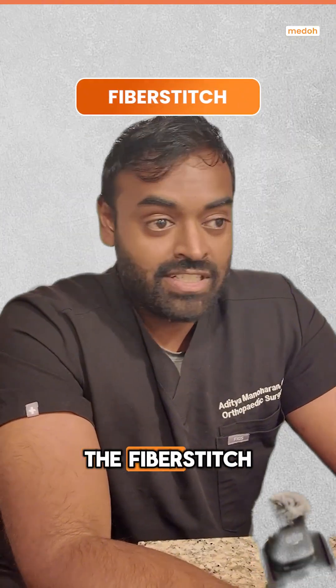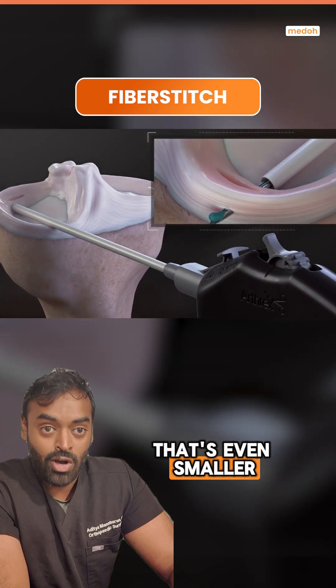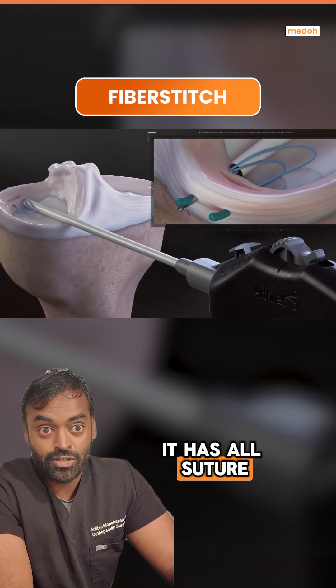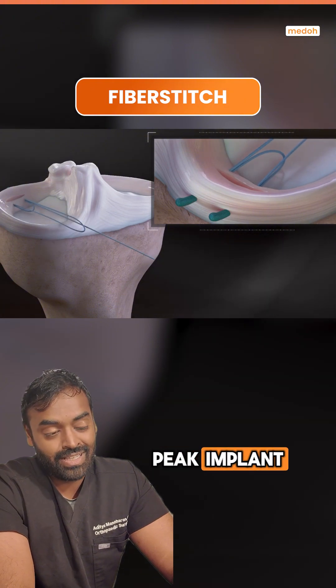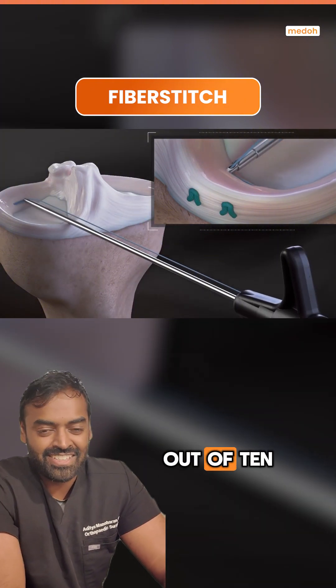Fiber Stitch. The Fiber Stitch is also very good. They just came out with a new version that's even smaller. It has all suture devices instead of a peak implant. And this is the one I'm currently using, so I'll go a little higher with a 9 out of 10.